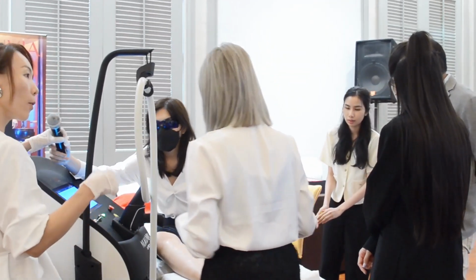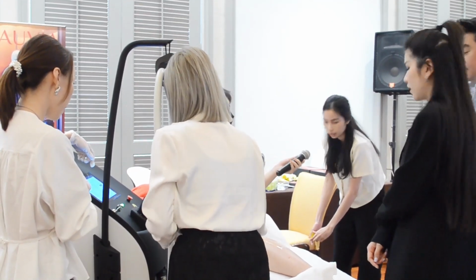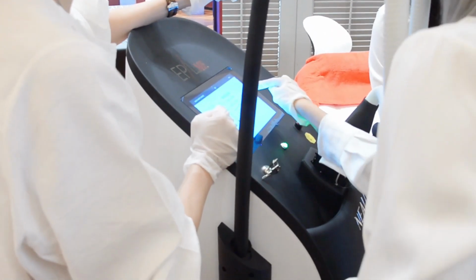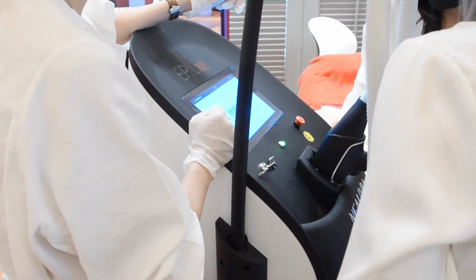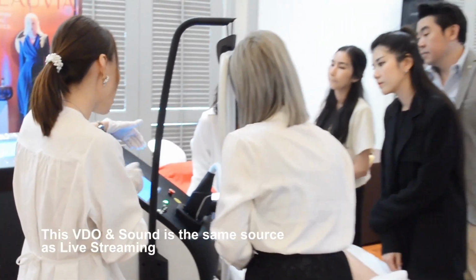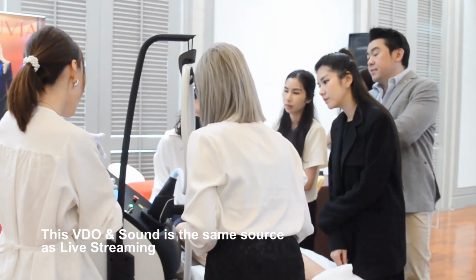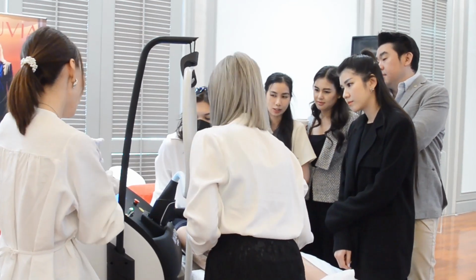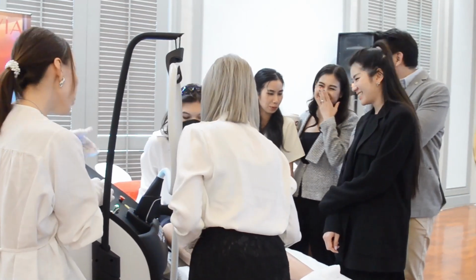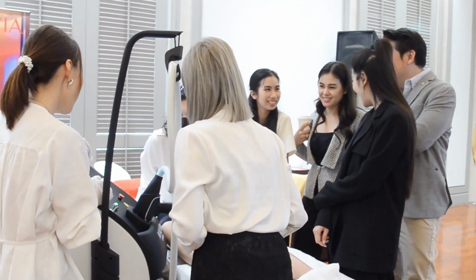Okay, so you can actually choose the basic mode, yes. And then again, we are doing a lower leg. Next step, female. Next. Okay, so actually I will prefix because it's the same patient, so you don't need to change again. But if this patient is of a lighter skin type, you can choose accordingly because you can see the color changes. But for Chutima, we choose she's 4. I don't think she's even 5. This is too dark. So I would say she's about 4. Okay, the hair color is about 2. So all this is prefixed. Okay, next. Pain mode.